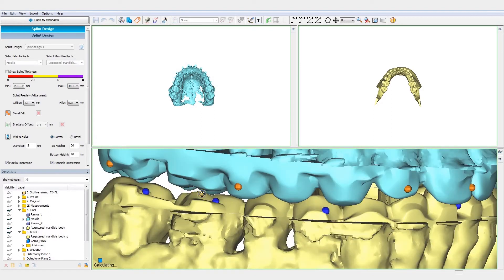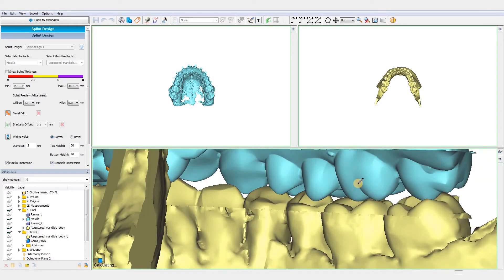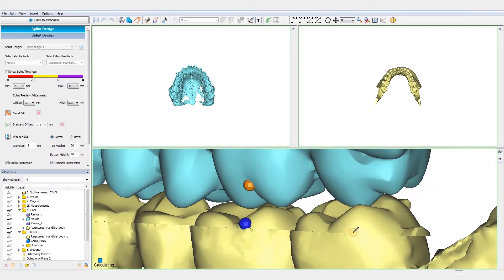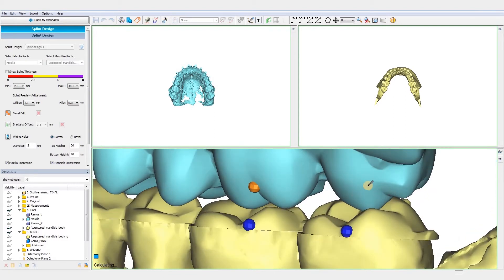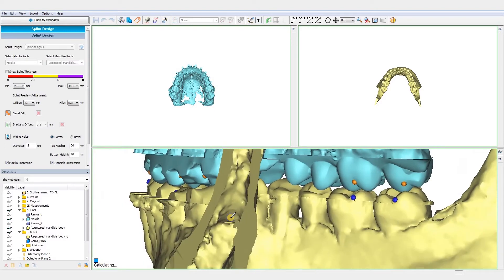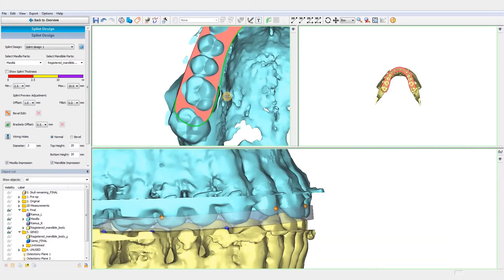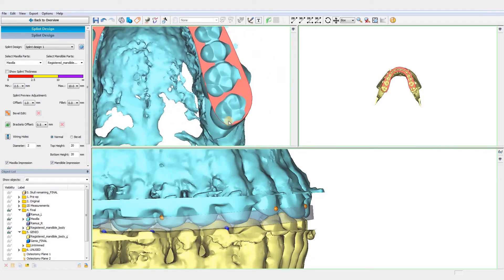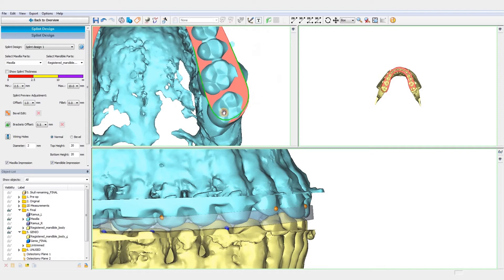Then, we can fine-tune this design and adjust the splint outline to our needs. To do so, we just need to grab and move the points. Moreover, we can control the size of the green line by holding ALT.